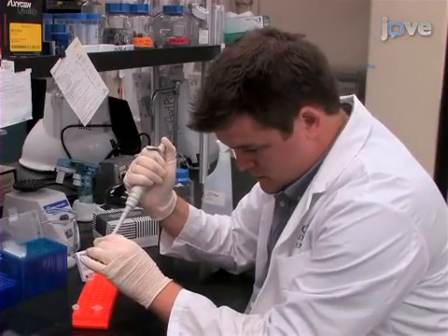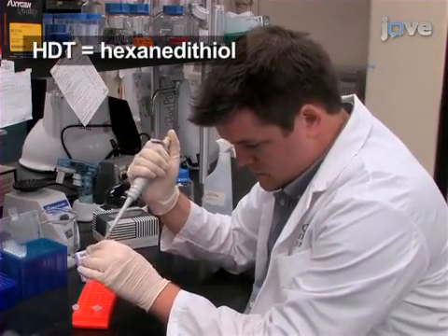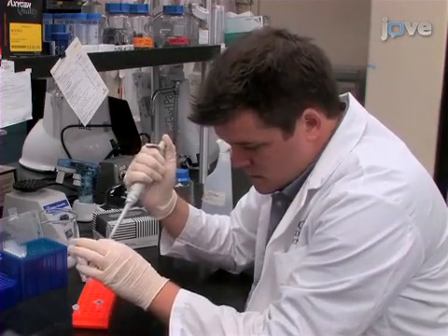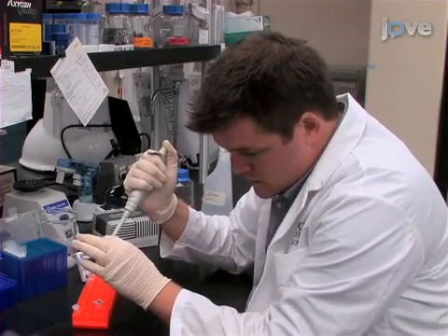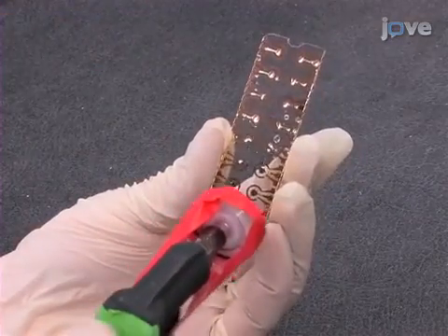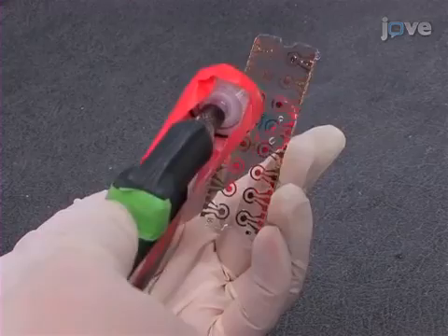Begin by incubating the thiolated capture probe with hexanedithiol for 10 minutes at room temperature to ensure that the thiol group on the capture probe is reduced, resulting in more consistent results. After the incubation, apply a stream of nitrogen to Bare Gold 16 sensor array chips for 5 minutes at room temperature.